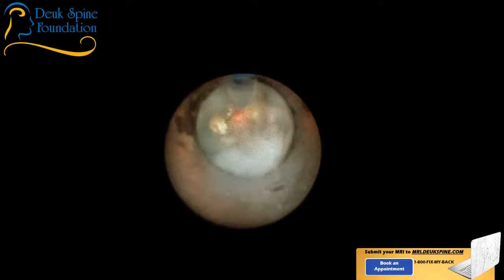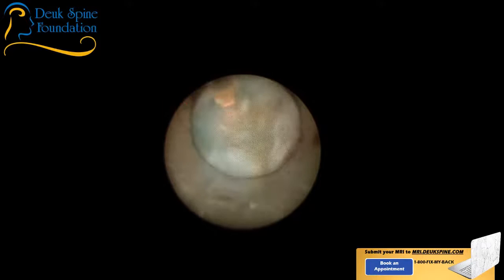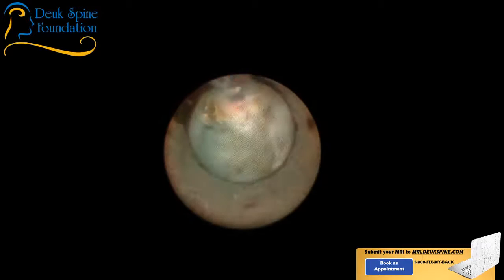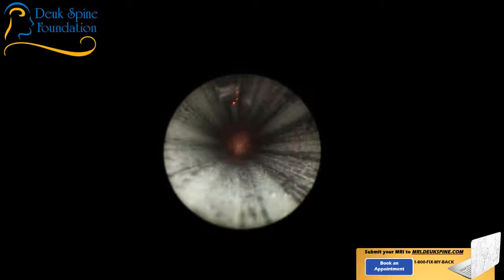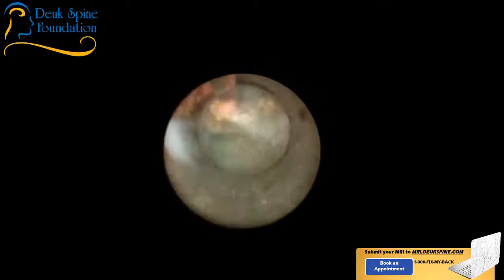What's new is that another piece of it has shot out recently. Her symptoms started about three days ago with weakness in her arm, pain from her neck down her arm, and neck pain starting to get some headaches. So she had another herniation recently, and that's why we're doing this surgery. This has both new and old herniation — that's typical. That piece of herniation came out of the foramen, right where the nerve is. So we're going to decompress the neuroforamen and clean up the annular tear so this thing will heal on its own.